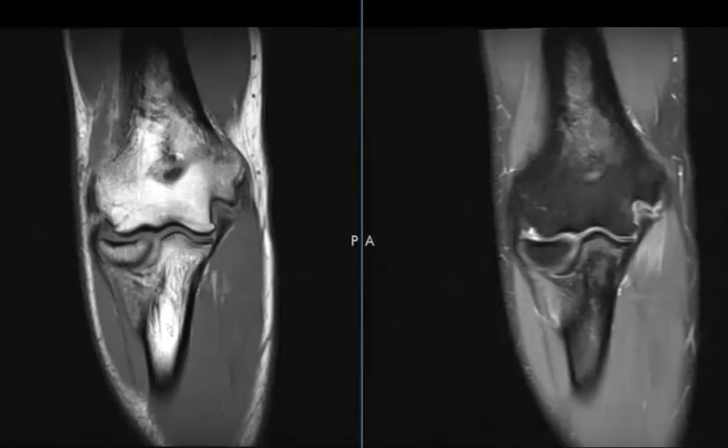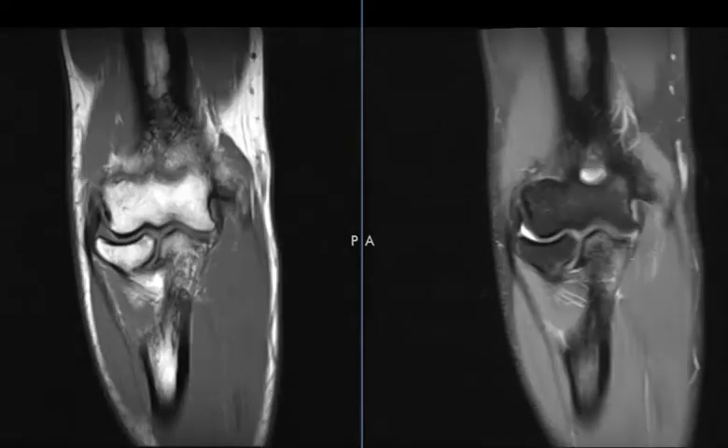Hello, this is Dr. Gay from First Second MRI. This is a 19-year-old male who injured their elbow playing basketball recently, and this is a coronal view.